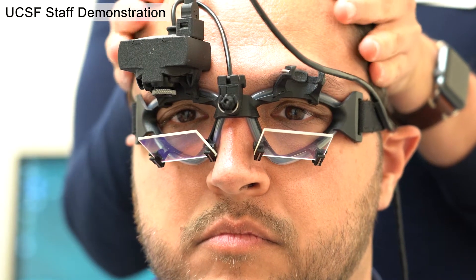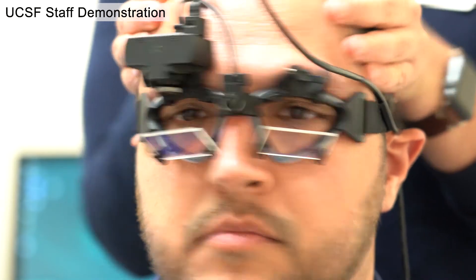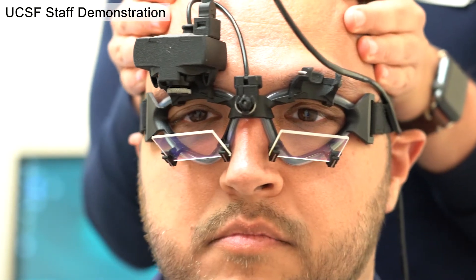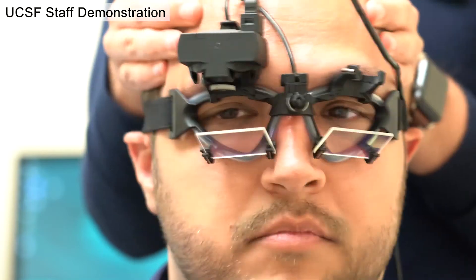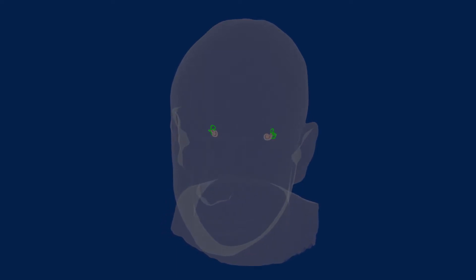If the vestibular system isn't able to sense the rotation, the eyes will drift away from the target, and then after a short delay, the brain realizes the shift in the image and refocuses back on the object. A video head impulse test can provide information about the functioning of all six semicircular canals, which are the parts of the inner ear that work together to sense head rotations in any direction.